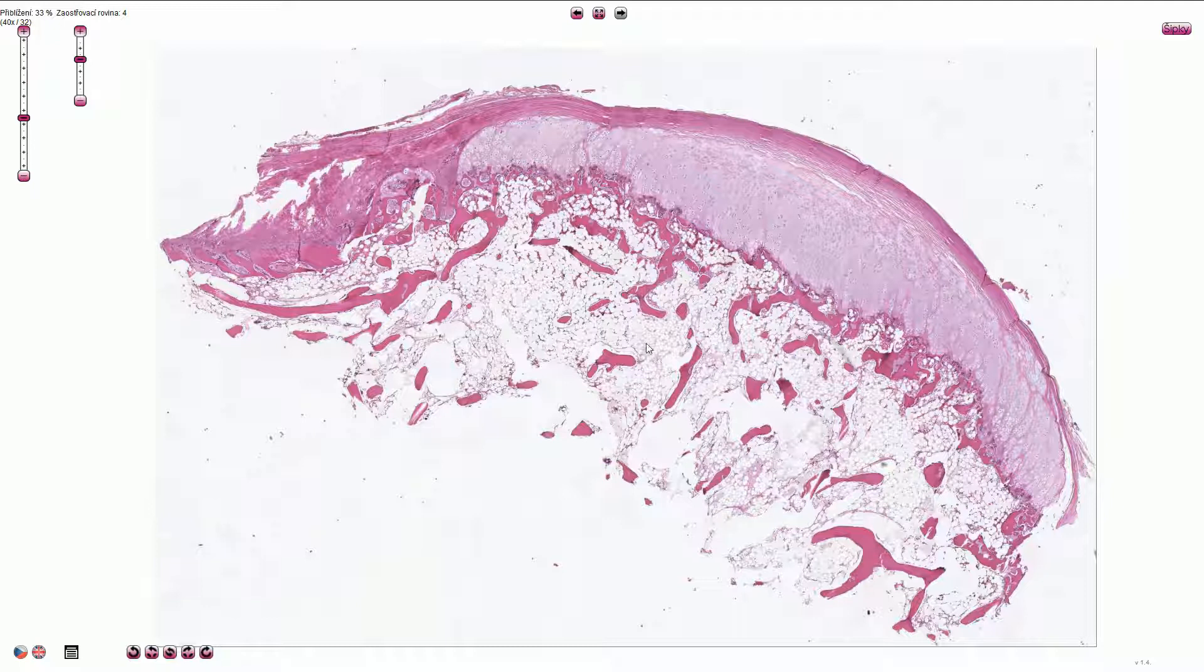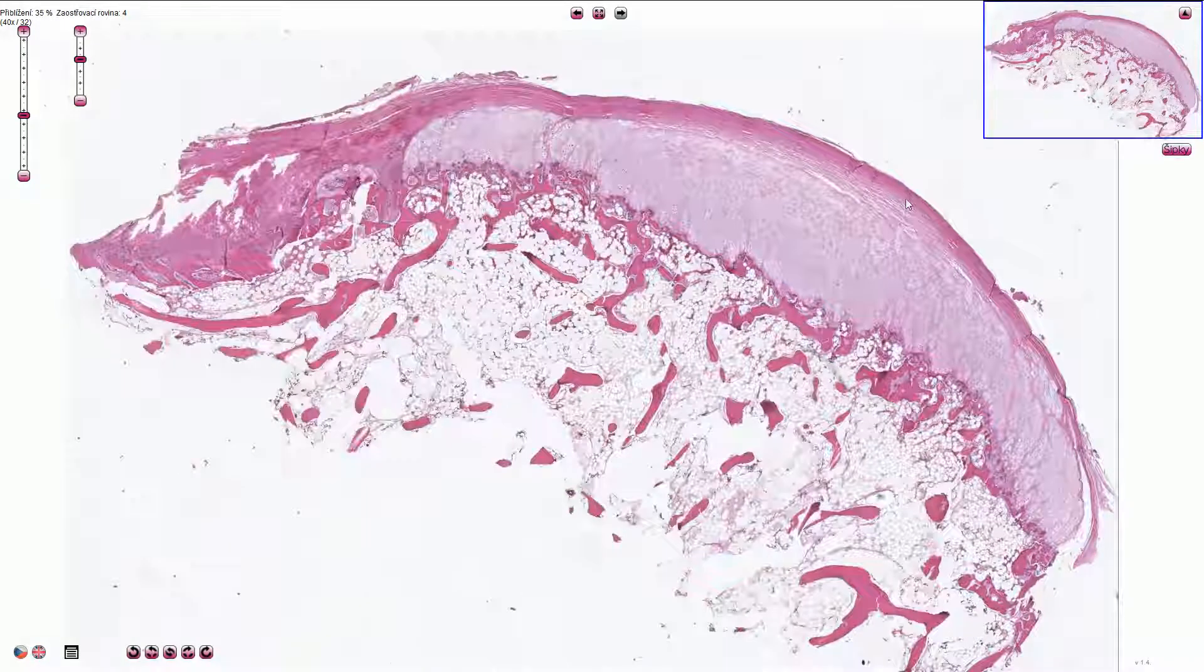It is composed of cartilage which creates a cap-like structure. On the surface we can find the fibrous layer which is perichondrium, and it is composed of dense fibrous tissue.